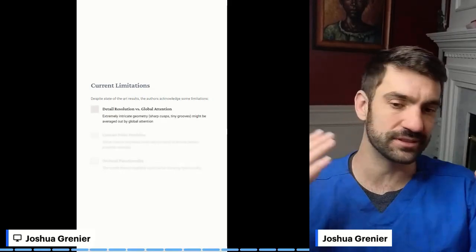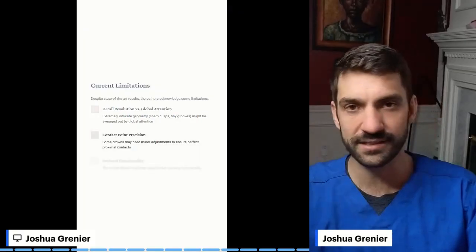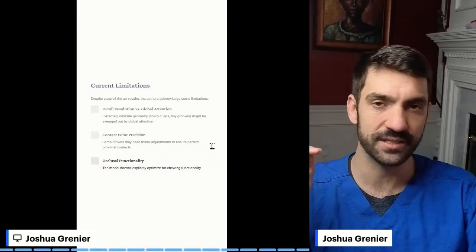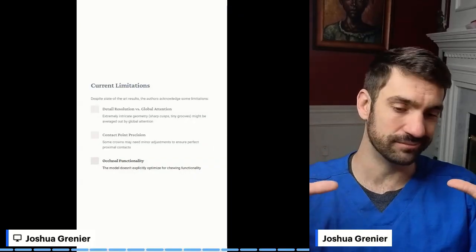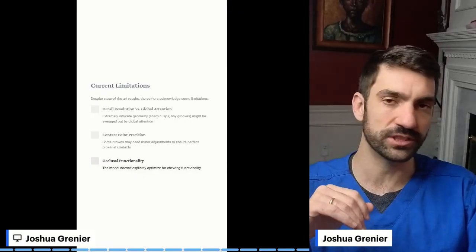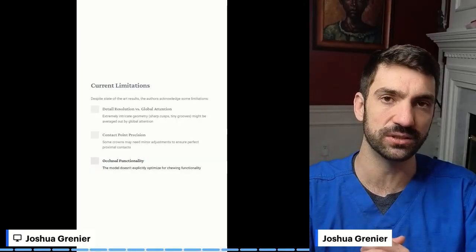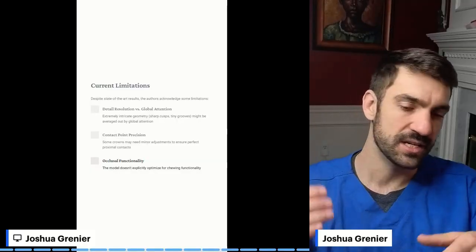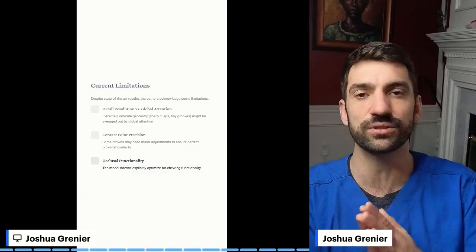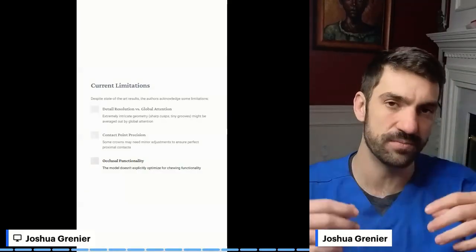And of course, they are worried about perhaps you're muting out details or oversimplifying some of these tooth shapes. Is that a big issue? That's difficult to say. A contact point precision. And of course, there's a lot more considerations you could bake into these, where when you look at occlusal functionality, the idea of how teeth actually move. That wasn't necessarily included. These were essentially just stamp cusps, which, assuming that's how it's going to go, it's also going to base it on the source of truth. So it's not necessarily looking at how an ideal occlusion would work or how that would actually work in motion.